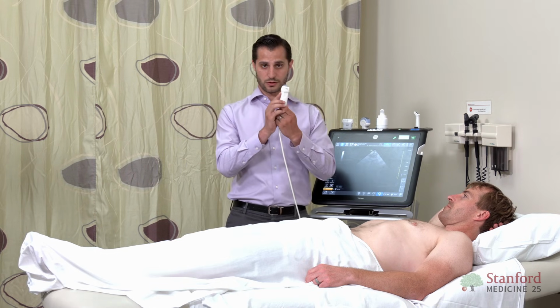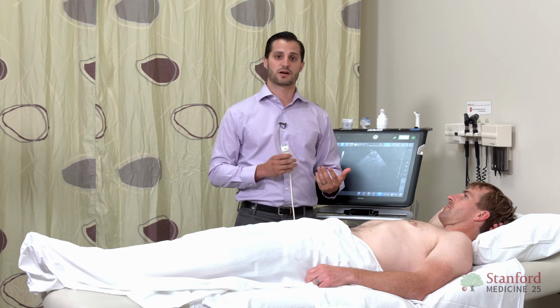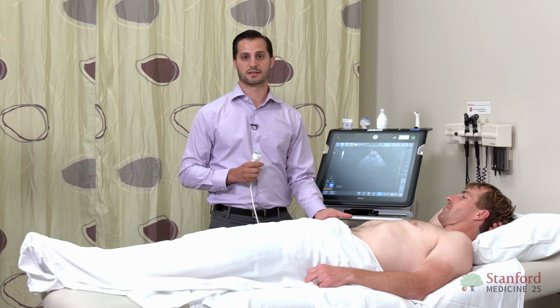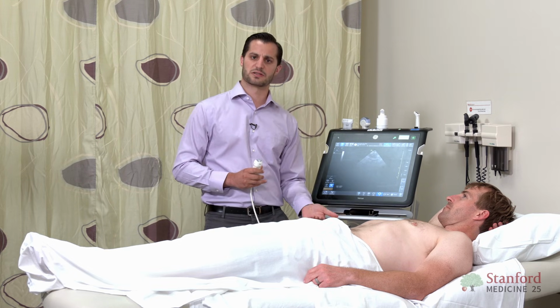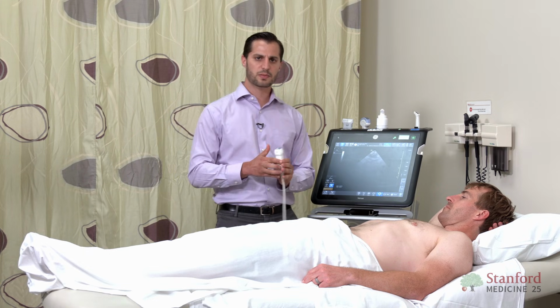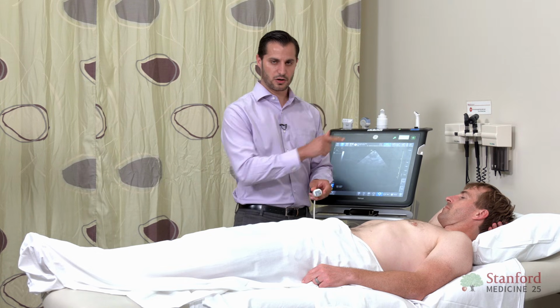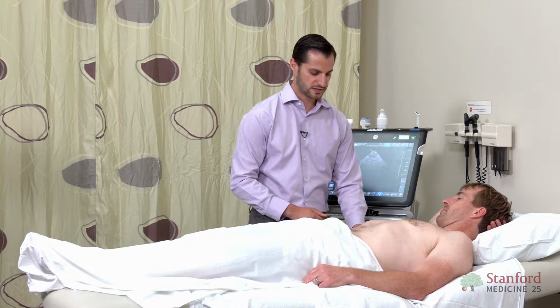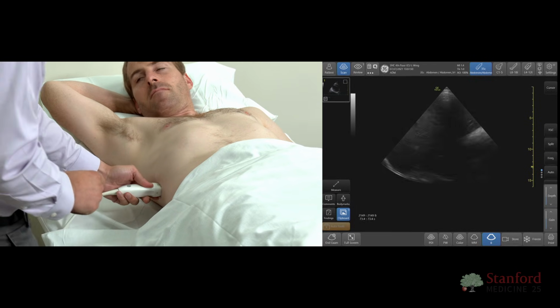My orientation marker is pointed towards the patient's head. A couple of other landmarks that are relevant include the anterior axillary line, mid-axillary line, and posterior axillary line. For renal ultrasound, I'm generally going in the mid to mid-posterior axillary line just because the kidneys are retroperitoneal organs. I'm placing my probe about in the 8th or 10th intercostal space with my marker pointed up towards the axilla, and my probe is going to be perpendicular to the patient. A little cold gel. I can also use my index finger to anchor myself on the patient.